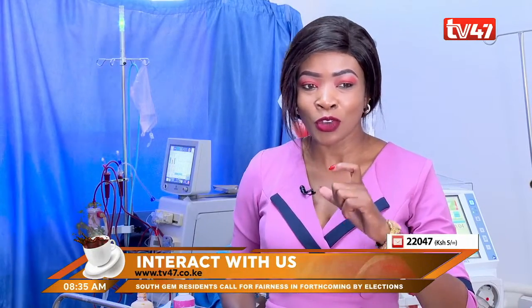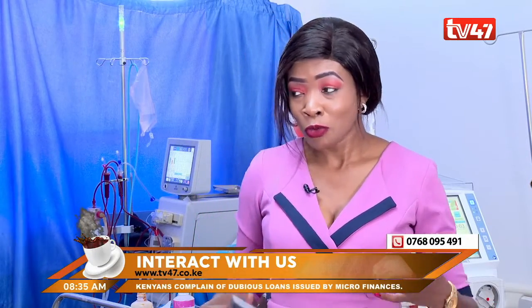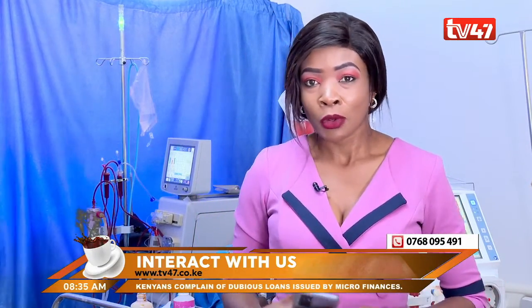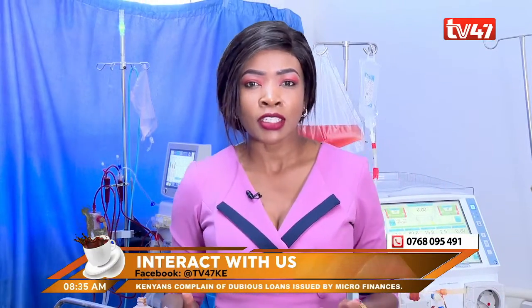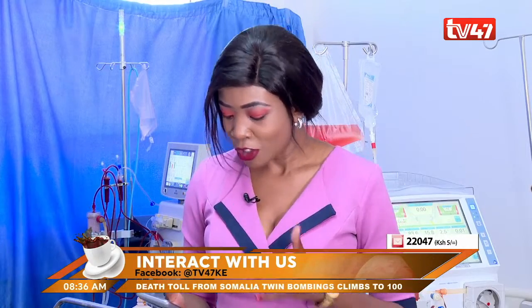Yes, you heard that. We are right at the heart of a dialysis unit — a renal unit, if you would like. We're here to get to learn some basics of dialysis, and taking us through that session is none other than George.